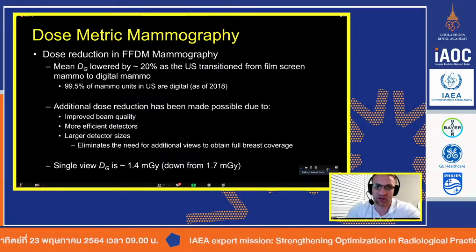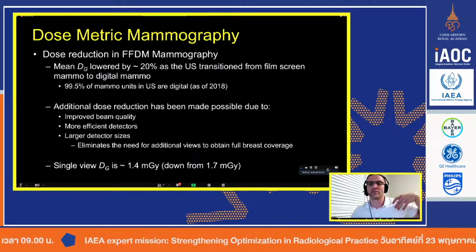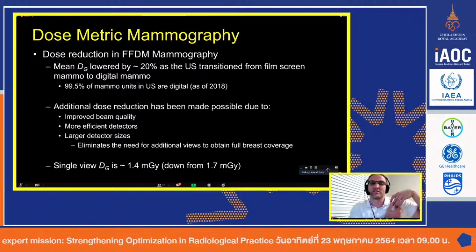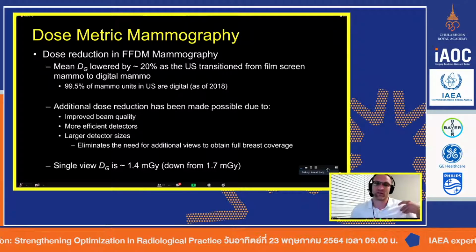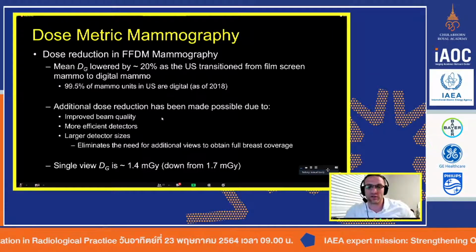And that is especially true for the MLO because you're trying to get the medial side of the breast, which is harder to see in a CC, but you got the medial side all the way up to the axilla side. And so that's just a lot of territory to cover that you need to make sure you have a good size field of view for that.